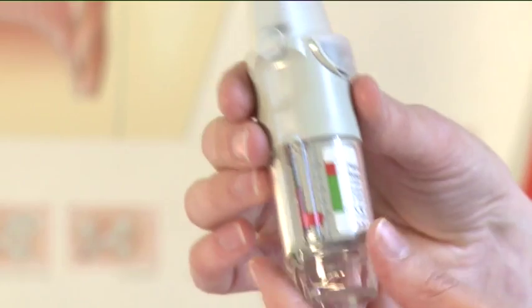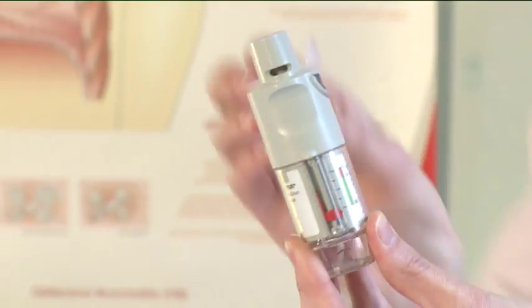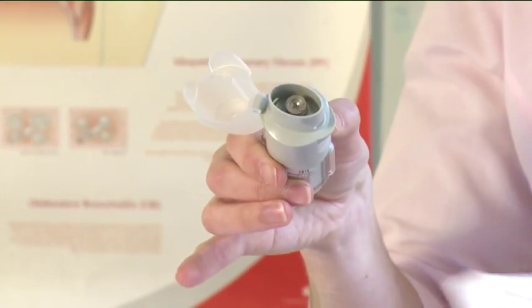To clean, wipe the mouthpiece including the metal part inside the mouthpiece with a damp cloth or tissue after use.